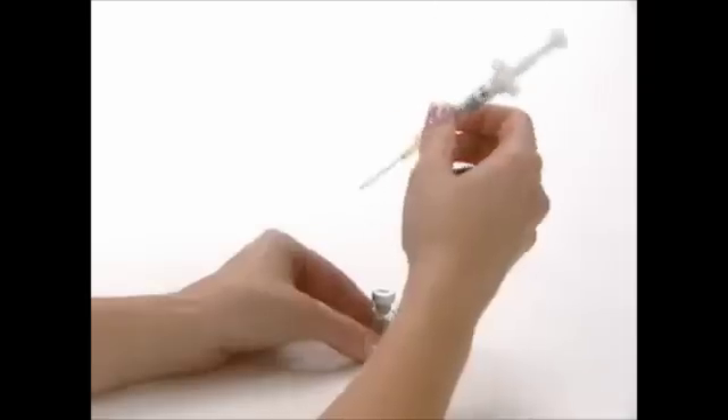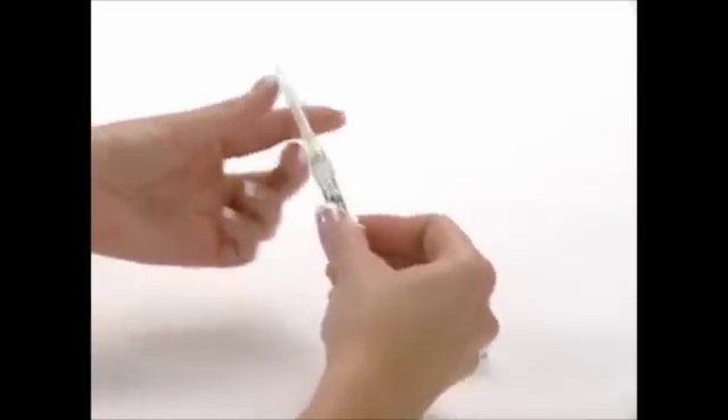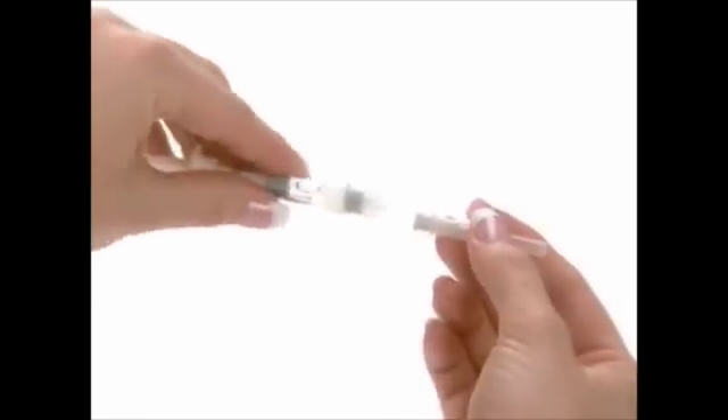Carefully remove the syringe needle from the vial. Recap the syringe needle and carefully lay the syringe down on a flat, clean surface. Detach the mixing needle from the syringe. Remove the wrapping from the gray injection needle and twist the injection needle onto the syringe, then remove the cover of the needle.